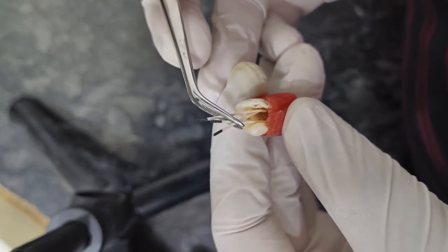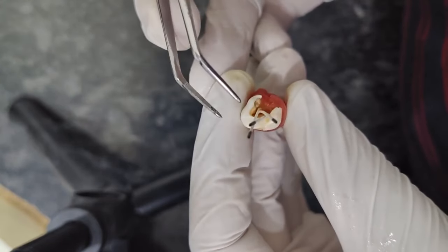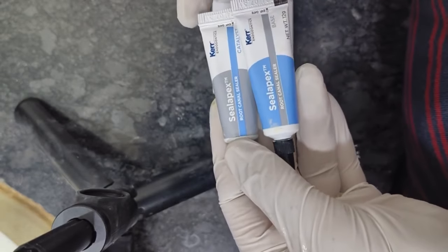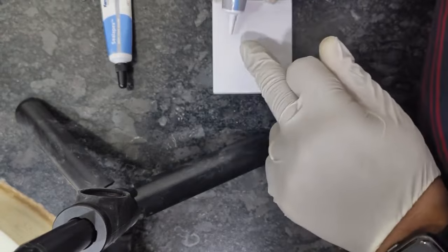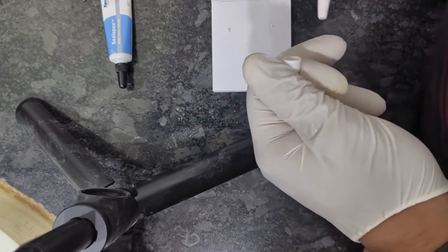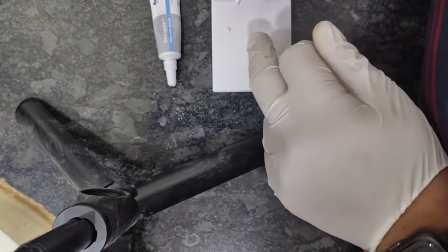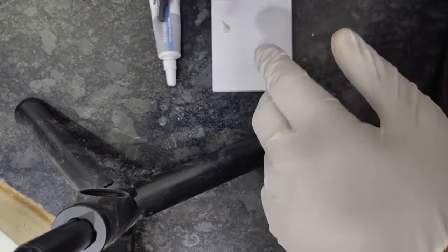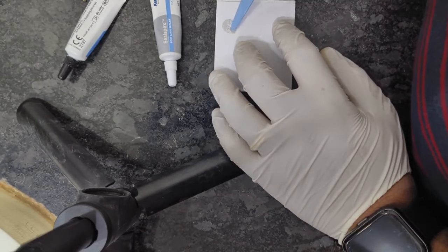So now we have proceeded with the obturation. So now we have prepared the tooth. We are using this seal apex sealant. This is the base and catalyst. And now we'll open it. So a little bit of base. And this was the catalyst. This is the base. So catalyst, you have to use little bit lesser amount. Now we just mix it uniformly.